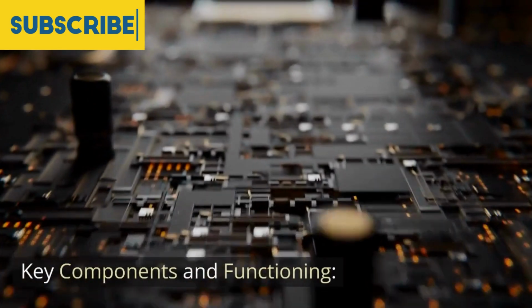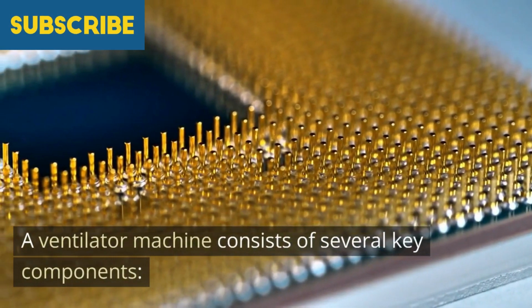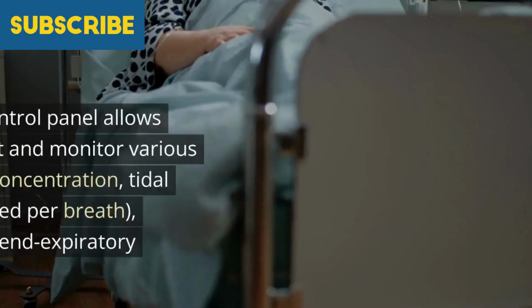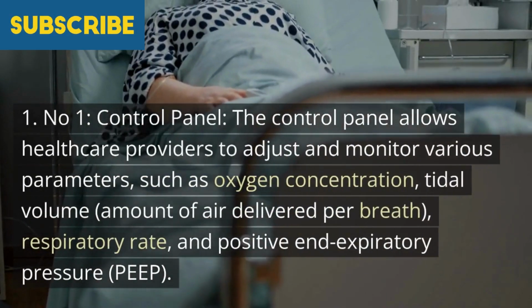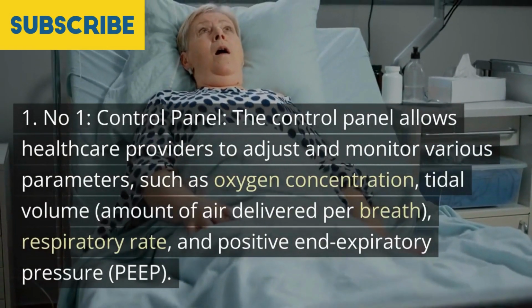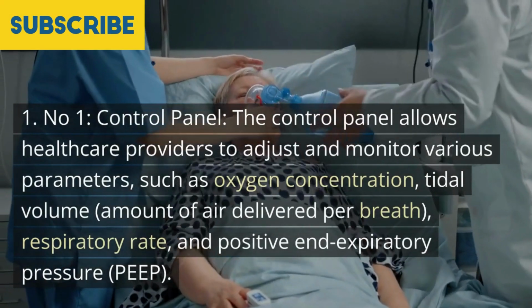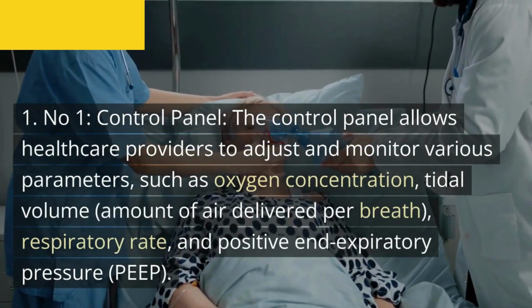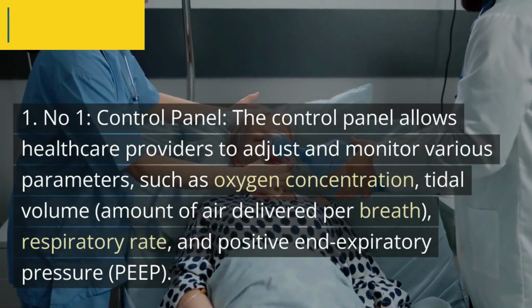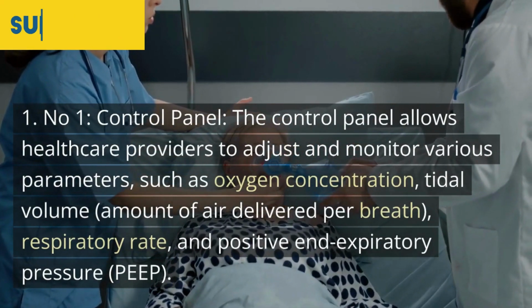Key components and functioning. A ventilator machine consists of several key components. Number 1. Control panel. The control panel allows healthcare providers to adjust and monitor various parameters, such as oxygen concentration, tidal volume, the amount of air delivered per breath, respiratory rate, and positive end-expiratory pressure, PEEP.